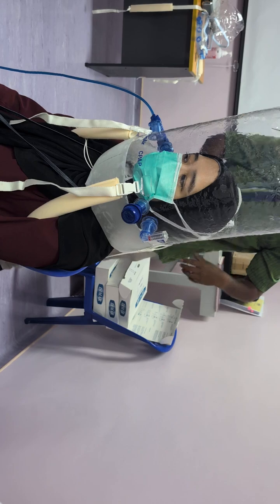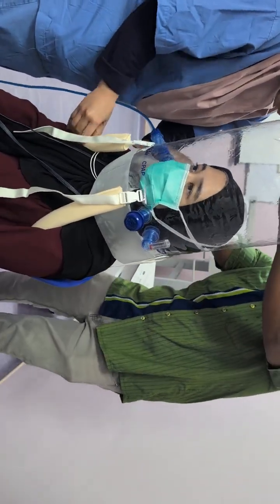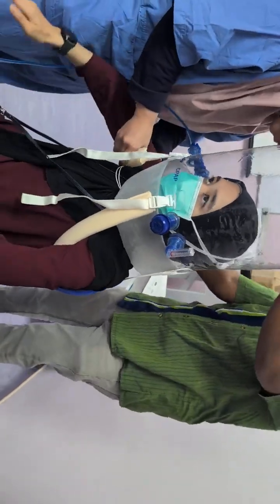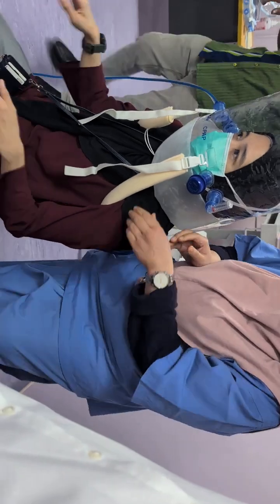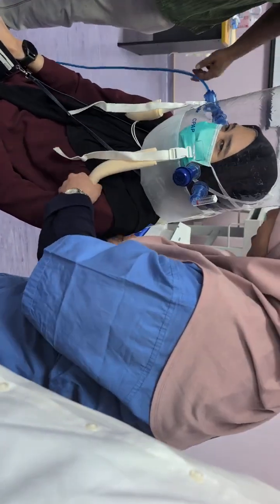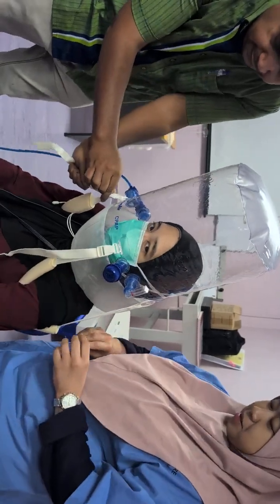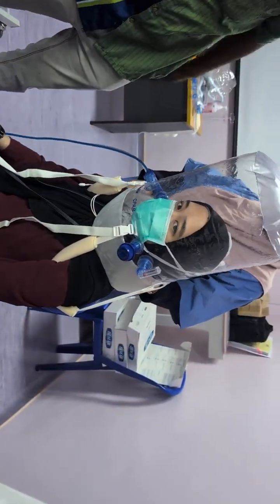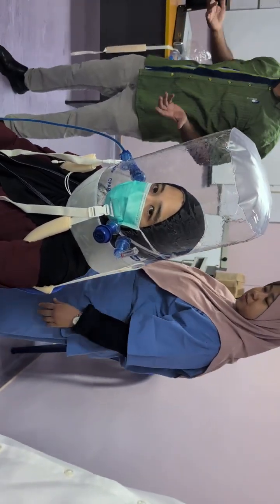The strap, can you bring it under the arm? The sponge must be under the arm. Okay, this side as well. Okay, so we pull it more. Okay, is this better? So the patient will be more comfortable.